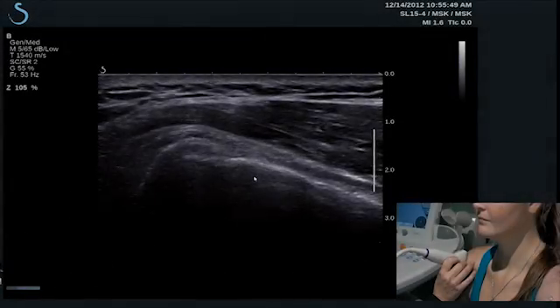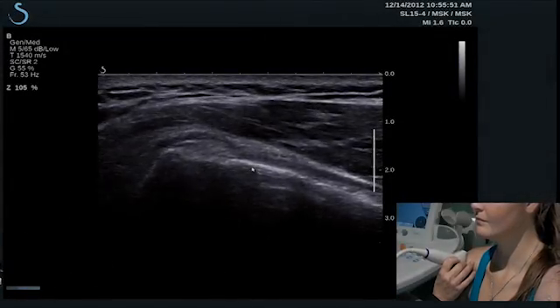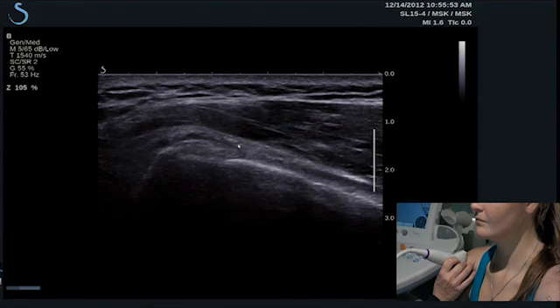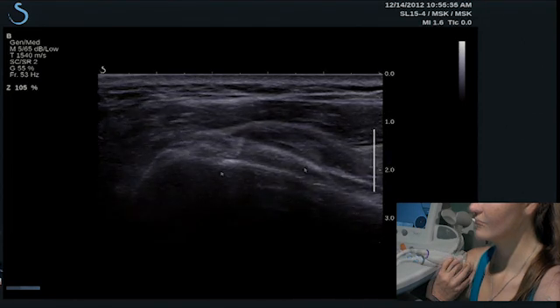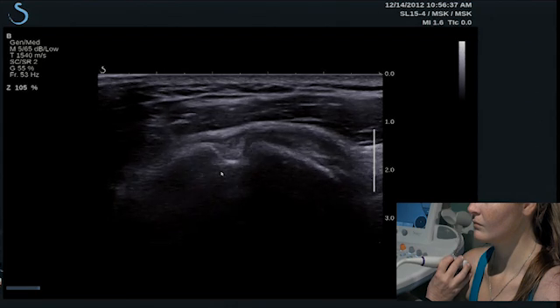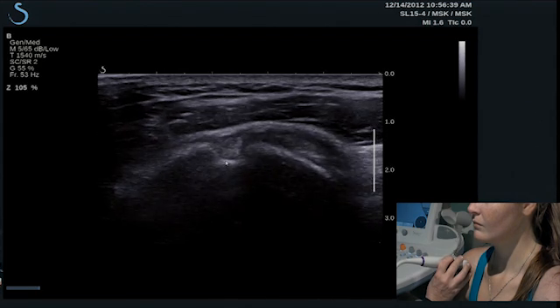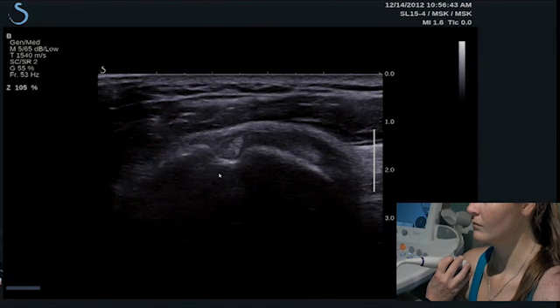The normal tendon has a hyperechoic fibrillar pattern, as we see here in this bicep tendon. In the transverse scan plane, we see the bicep tendon in the bicipital groove as a hyperechoic oval structure.